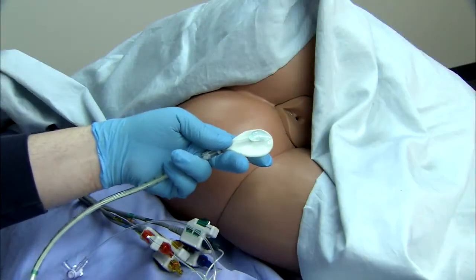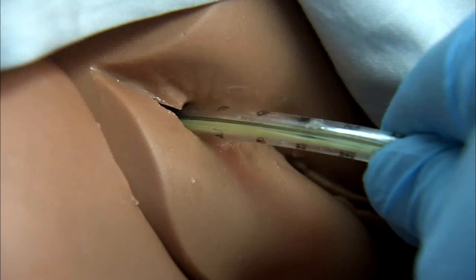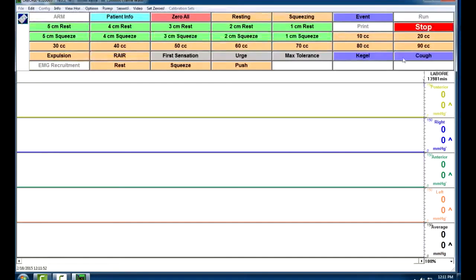Lubricate the anorectal manometry catheter and gently insert into the anus at least to the 8 centimeter mark. It is very important that you make sure that the black line is towards the patient's posterior side, which is their spine. So a nice little mnemonic to remember is make the line to the side of the spine, the line to the spine. Click Run to start your recording.